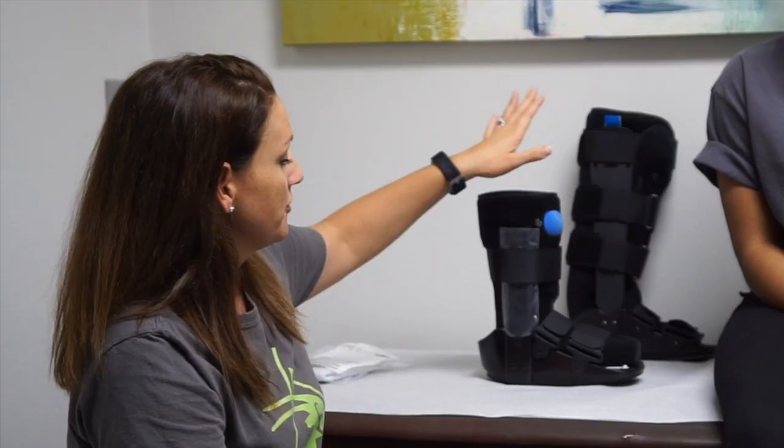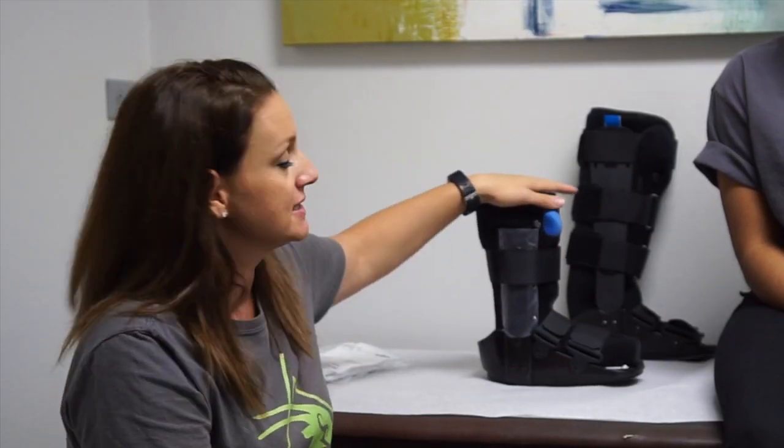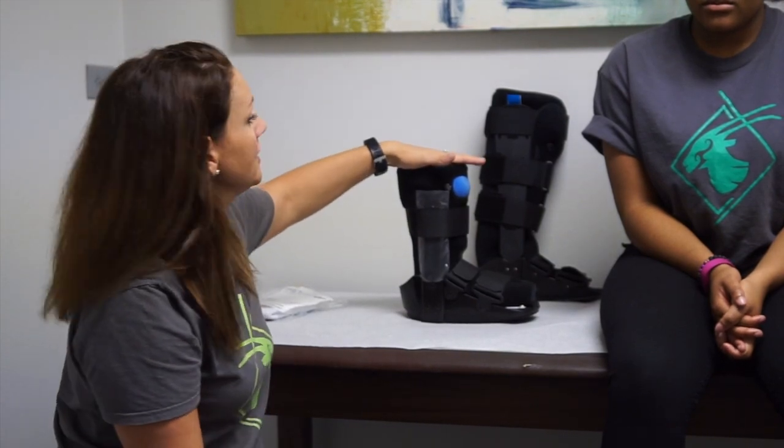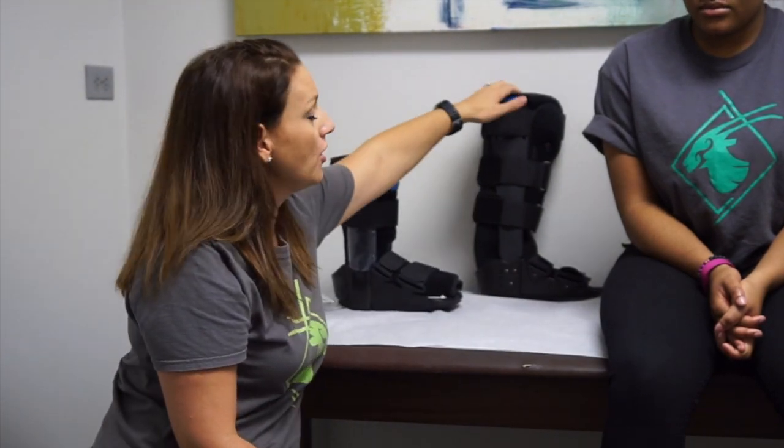Today I'm going to show y'all how to put on a short fracture walker or pneumatic ankle walker. Fracture walkers come in different sizes, in pediatric sizes all the way through — some brands offer an 2XL. They also come in different heights. This is an ankle walker, also referred to as a short walker, and then there's a tall walker.